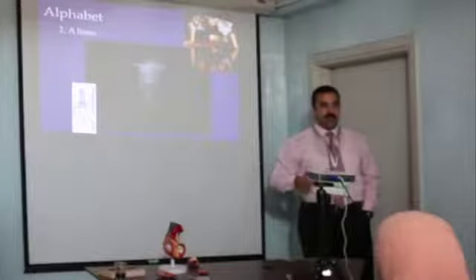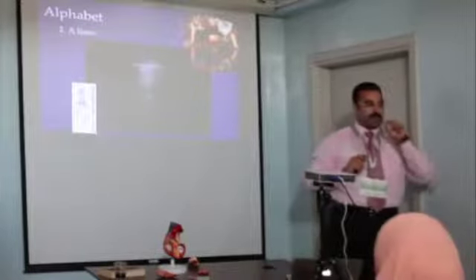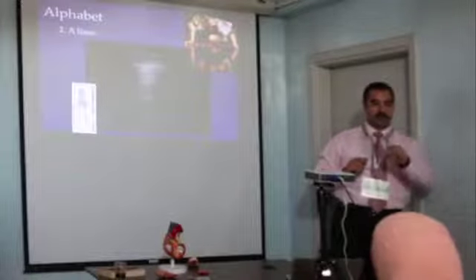Clear? If you find this sign, just before you go, okay? This is an indicator of normal lung tissue. Okay? There's no problem with this lung. Okay?